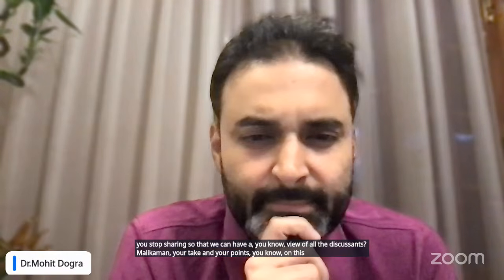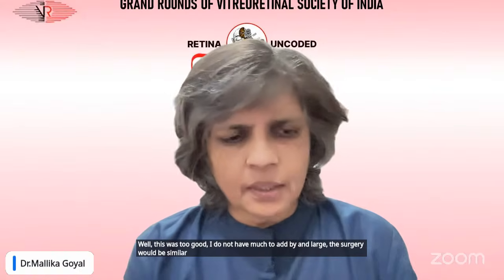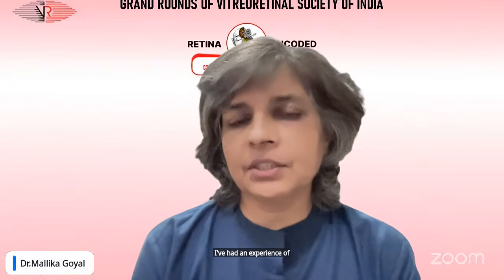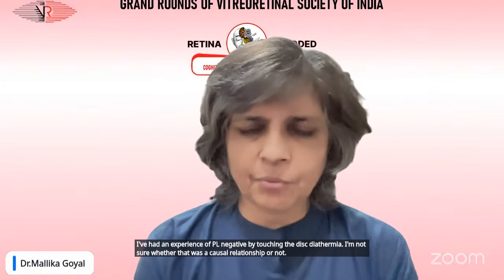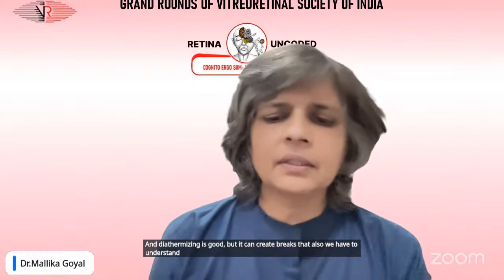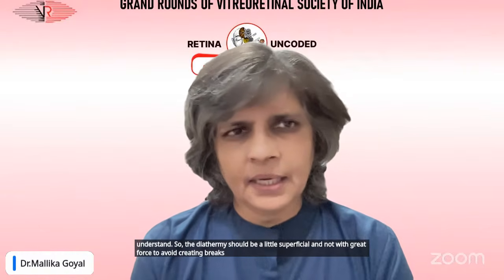Well, this was too good. I do not have much to add; by and large, the surgery would be similar if I were to do it. I think we should avoid diathermy close to the disc or on the disc. I've had an experience of PL negative by touching the disc with diathermy. I'm not sure whether that was a causal relationship or not, but we have to be careful with that. And diathermizing is good, but it can create breaks. That also we have to understand. So the diathermy should be a little superficial and not with great force to avoid creating breaks. That's what I would say.